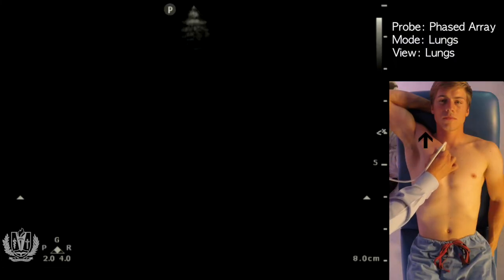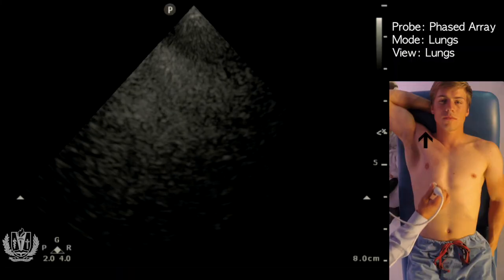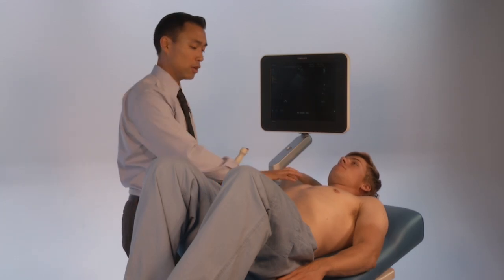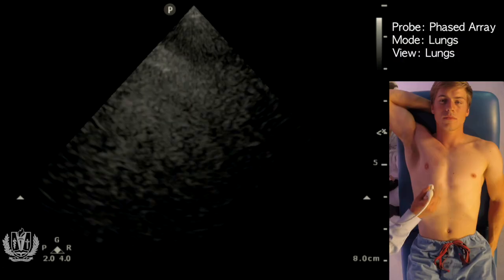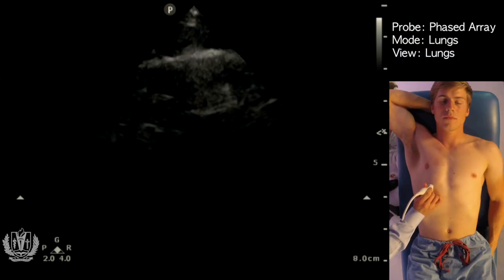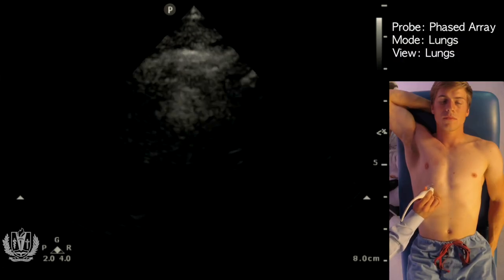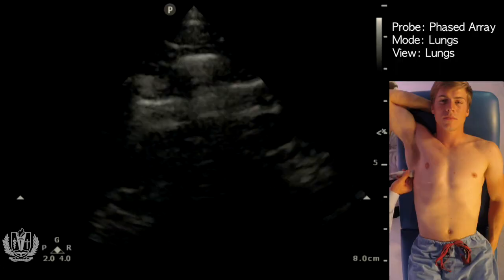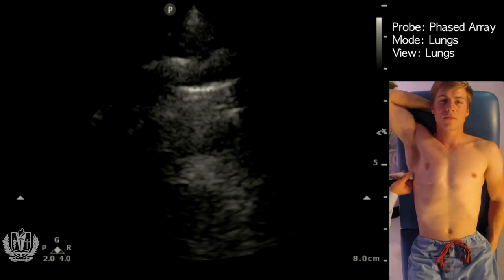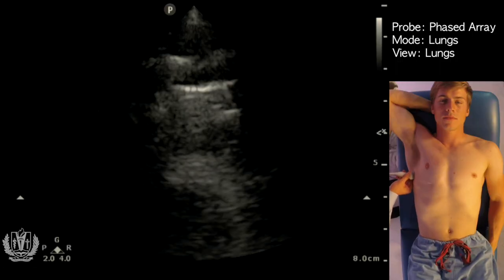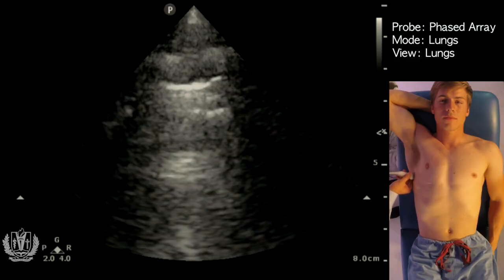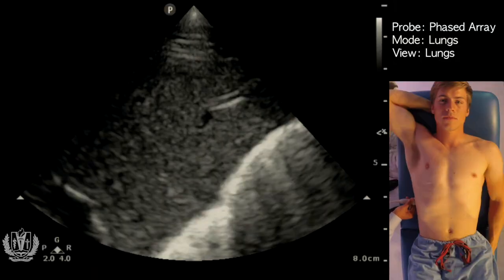You can scan the patient using that same process, looking for A-lines, B-lines, as well as any effusions at all six quadrants. Going through each one, here is a quadrant looking for lung sliding which we see here, and moving towards the mid area, we once again see lung sliding.